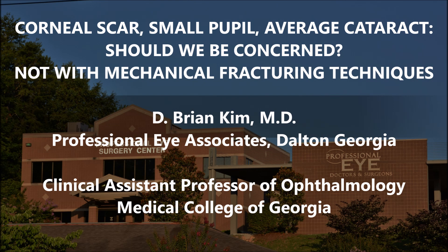I don't need to use Trypan Blue. Again, with the corneal scar and the small pupil, I'm able to still perform mechanical fracturing techniques — double chop, cross chop — because I know I can place my instruments within the bag underneath the anterior capsulorhexis edge and use mechanical fracturing forces to disassemble the lens.